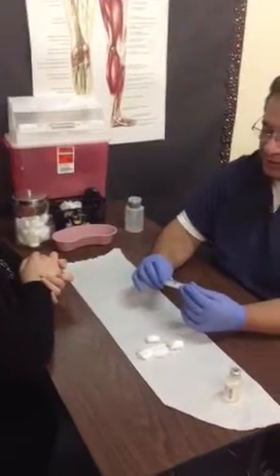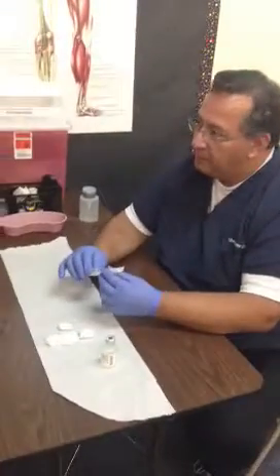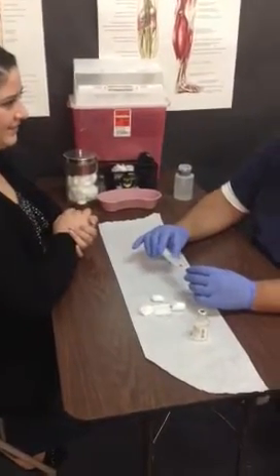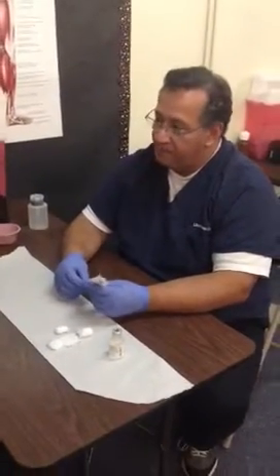Okay, and Jane Doe, are you allergic to anything I'm going to be using like the sodium chloride, cotton balls, metal, or adhesive? No. Okay. Do you have a preference on which side? My right. So what I'm going to do is get prepped up and then we'll come back and give you the injection. Hang tight.